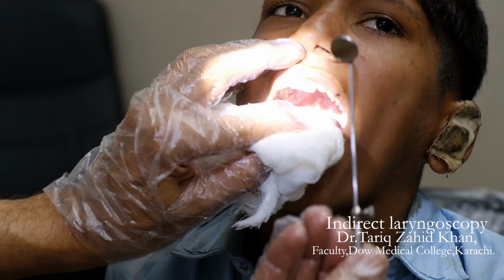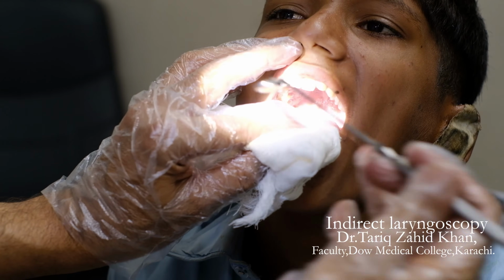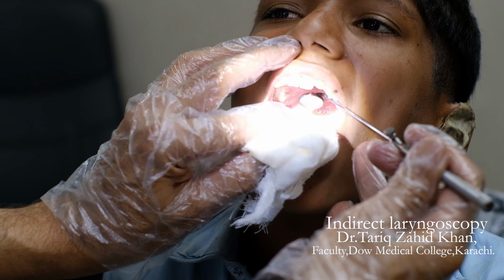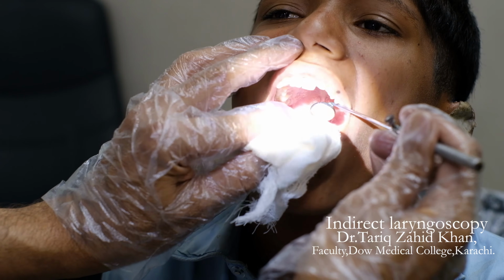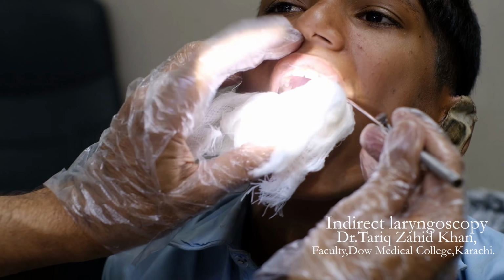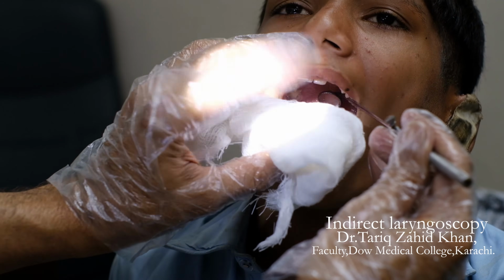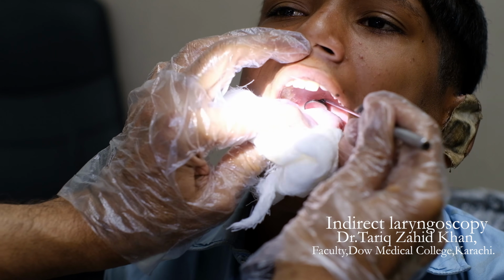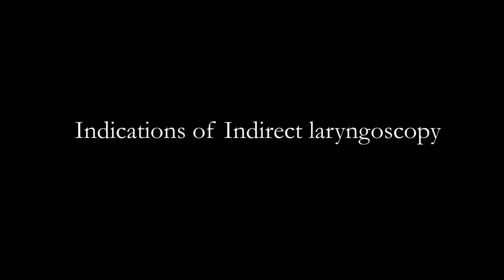Now you will introduce this mirror inside the mouth of the patient, just underneath the soft palate, like this. Try not to touch any structure, otherwise the patient will start gagging. Okay? Yes. Protrude your tongue out, beta. Out. Yes. Take a deep breath from your mouth. Say E.